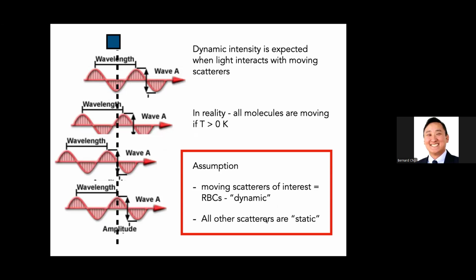So basically, two types of Brownian motion. You have something of interest, and something way lower. That's just, let's say, the matrix, the collagen, or the surrounding non-vascular areas that also have some particle motion just because of Brownian motion. So there's this discrepancy. Static is a loaded term, but we have particles we would call static, and ones called dynamic. And with blood, we'll call that dynamic.